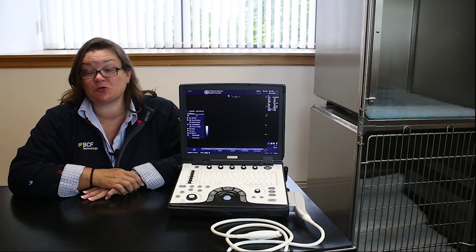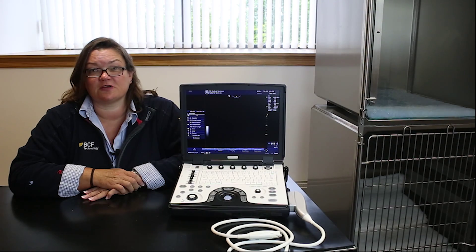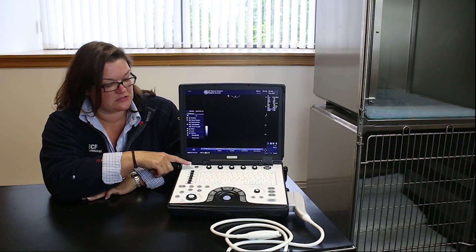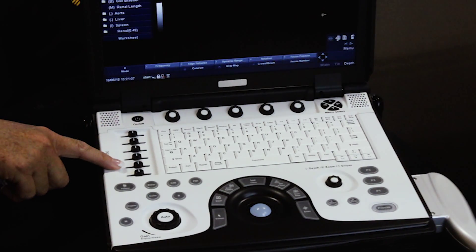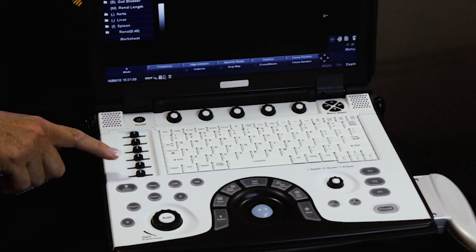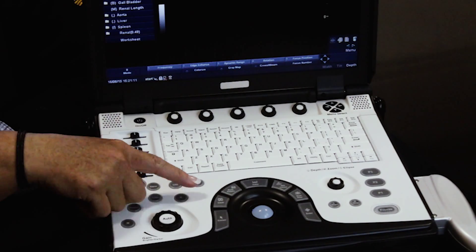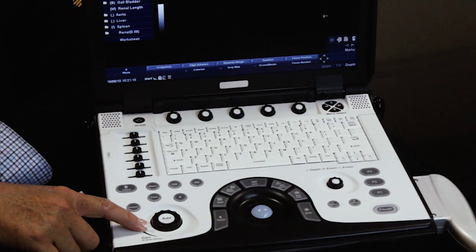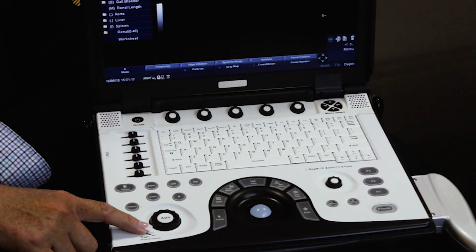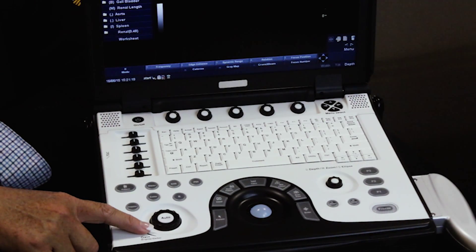Let's have a quick tour of the keyboard and the functions. Directly below the on-off switch, you've got your time gain compensation slider buttons. Beneath that, we have various mode keys that all sit above the overall gain button, which is one of the more important keys that you're going to be playing with throughout your exam.